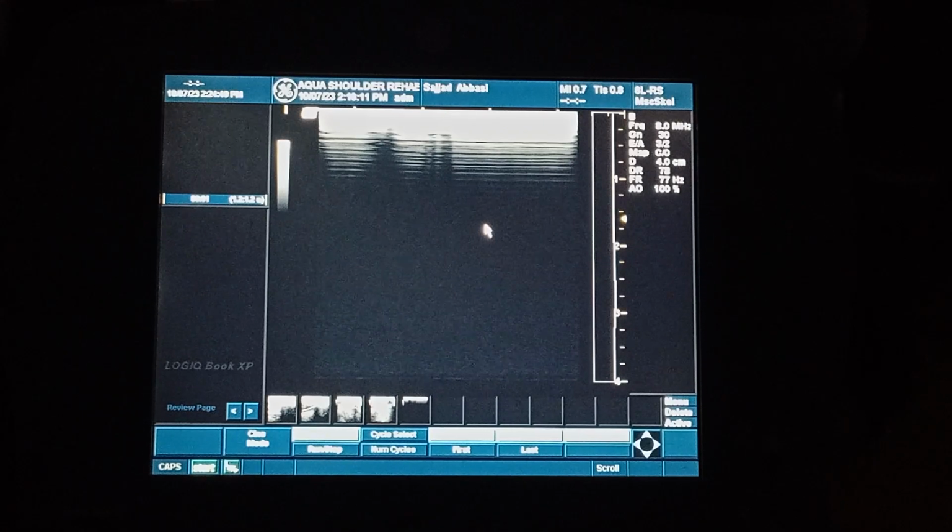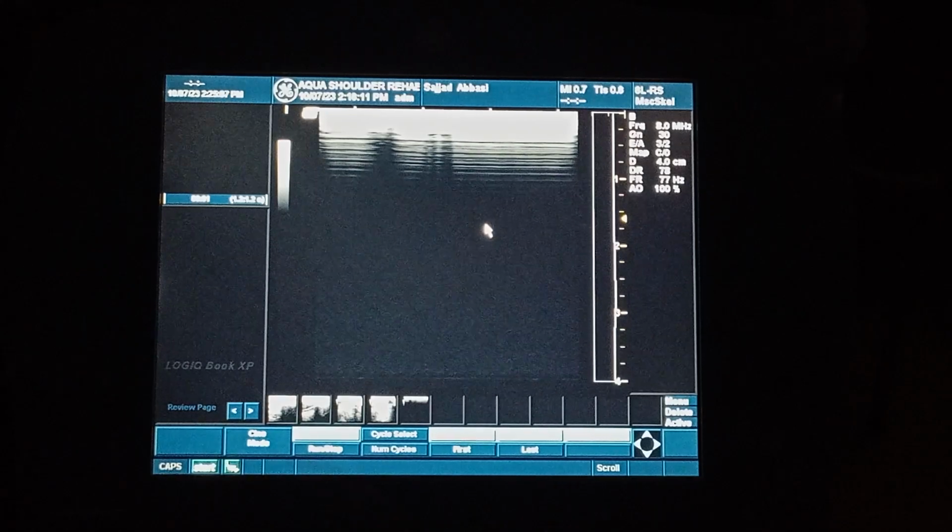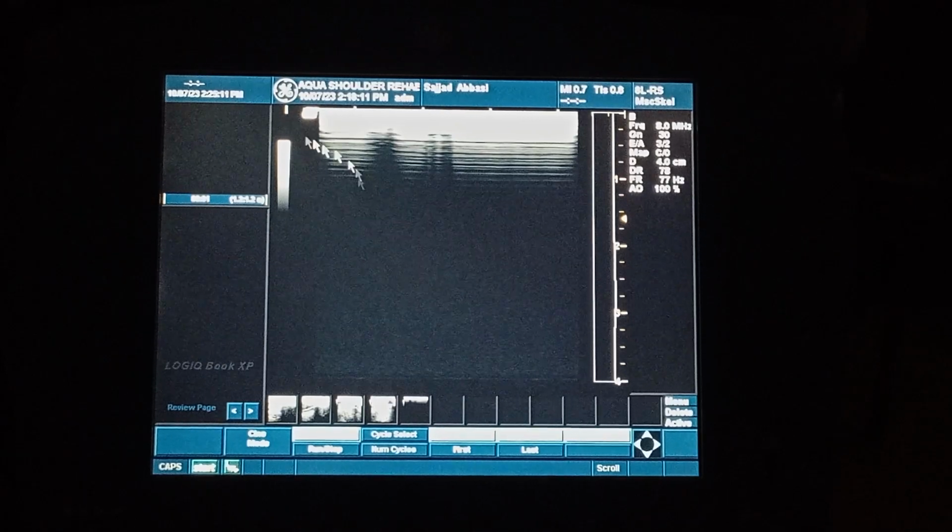So in this video we are going to talk about the interface of the ultrasound machine. This interface is very easy to understand and remember, and we should always remember how things work, because these also tell us about the directions, what the x-axis and y-axis are, and similarly how we can go superficial and deep, and what is meant by the words or the headings that are written onto the screen. So let's start from the top left.